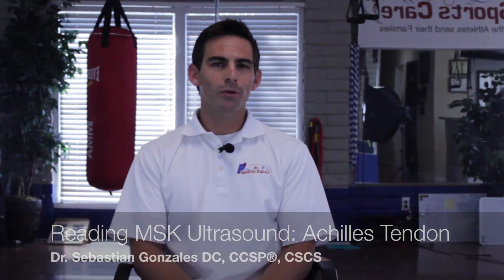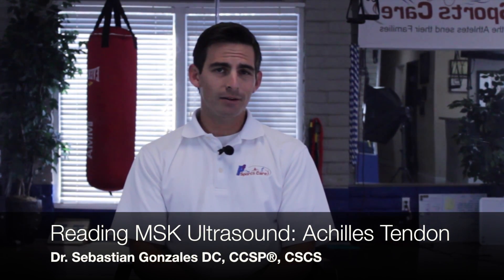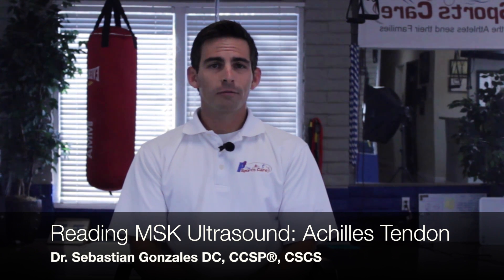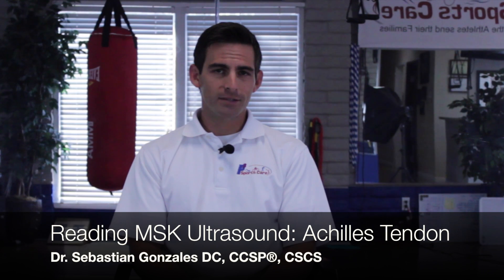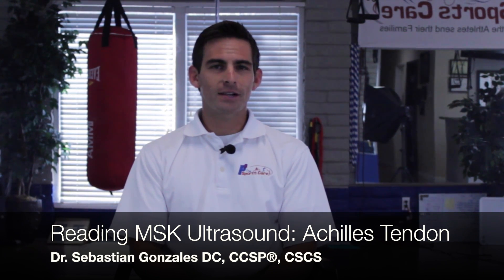Hi, this is Dr. Gonzalez again. Today we're going through some demonstrations of how to read MSK ultrasound for the healthcare provider. We're going to show mainly an Achilles tendonitis case today, and I think you'll see that it's actually very easy to see, and you'll feel more comfortable reading your images after this video.